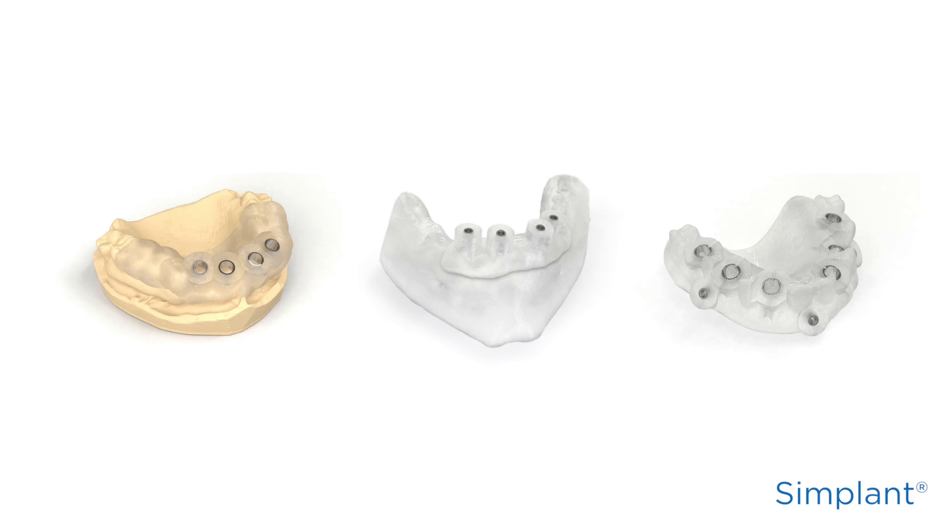So that's it. You've now learned how to prepare and use the Simplant Guide and the surgical instruments that you will use. You're ready for a more precise and predictable surgery.